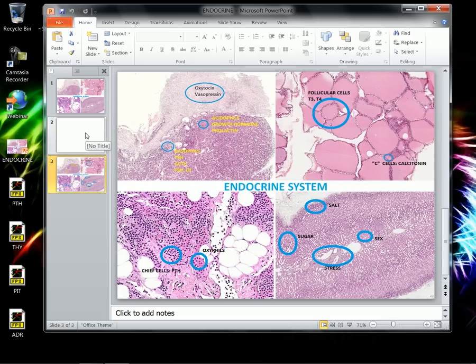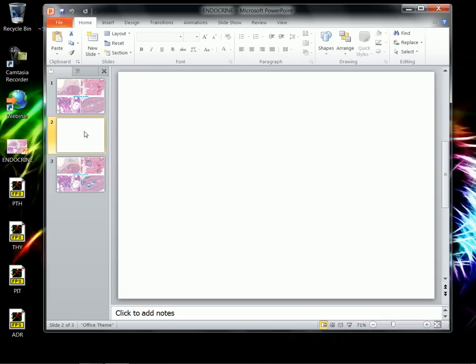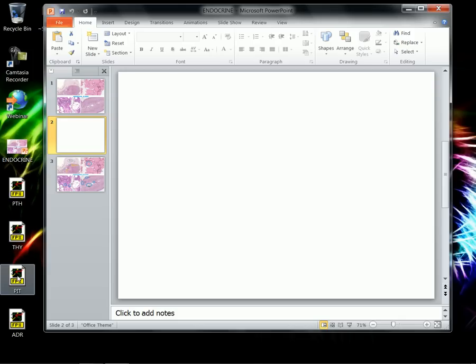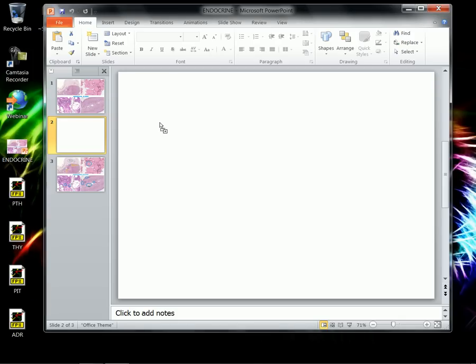But let's say you wanted to go a step further and you had what you can see here is an image slide that is zoomable in the FPX format. And this one I named Pit for Pituitary. I am dragging that thing onto a blank PowerPoint slide.